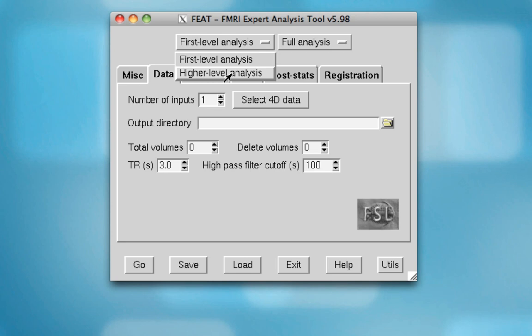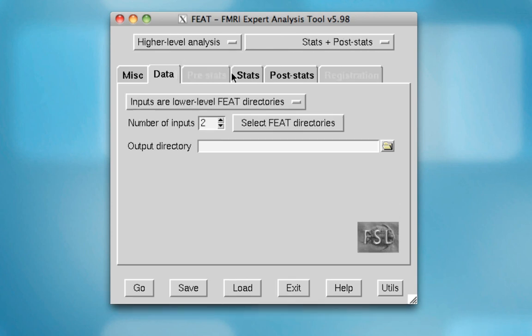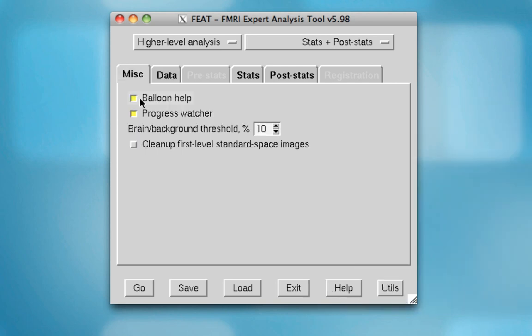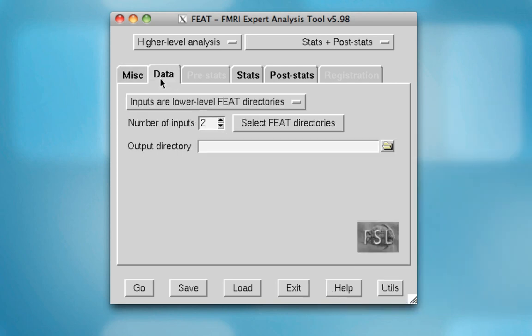Now that we have more than one run, we can do a higher-level analysis to collapse across runs and combine parameter estimates. So on this drop-down box, select higher-level analysis, and select inputs are lower-level feed directories, which will be the default.